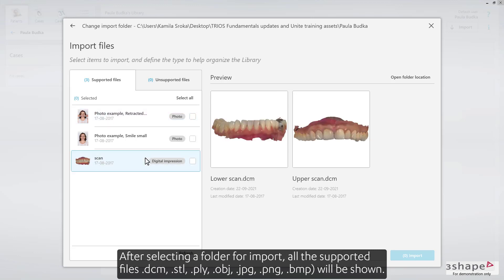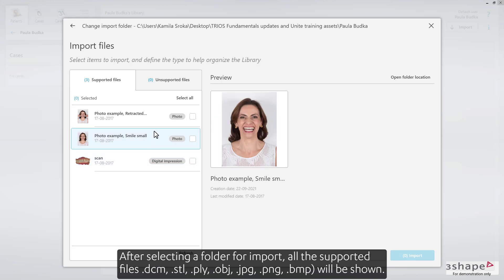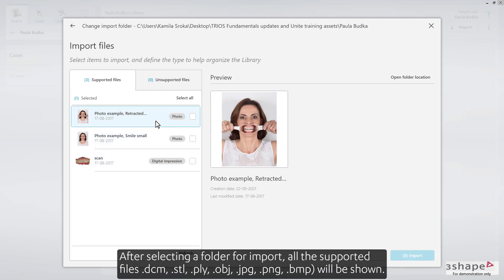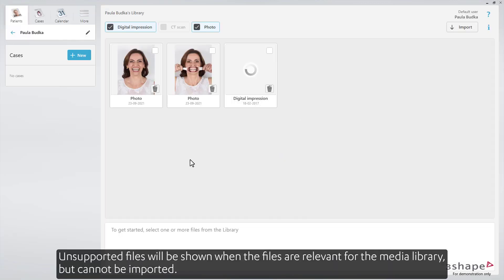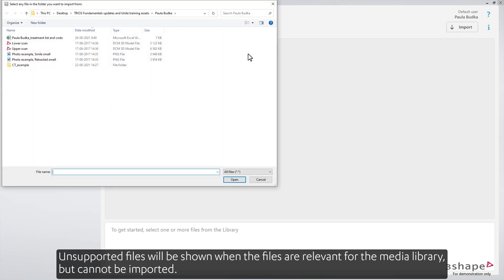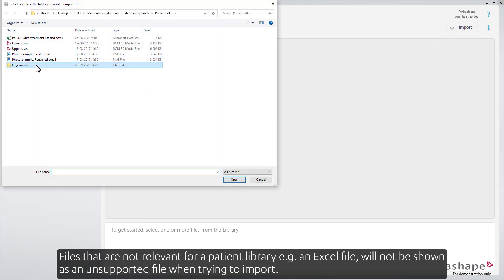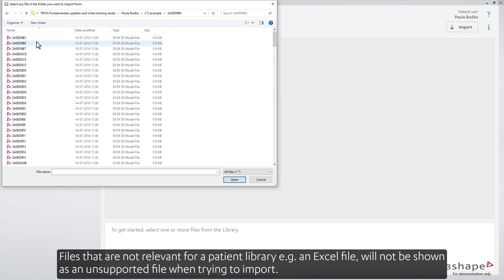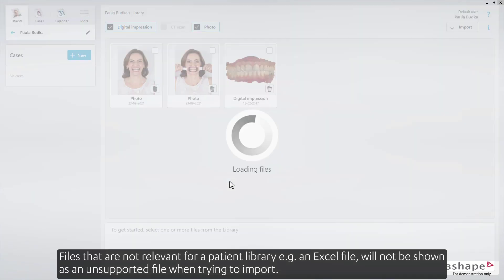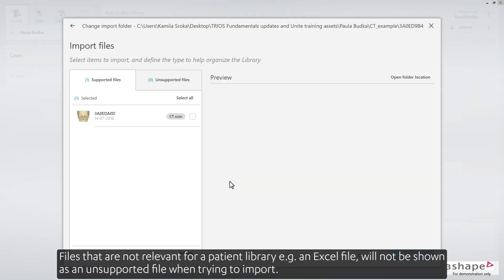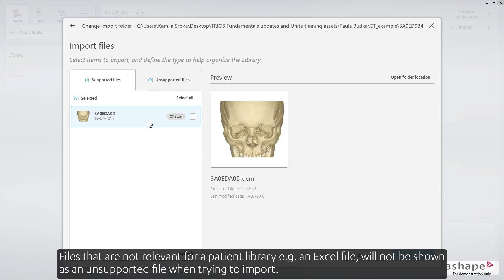After selecting a folder for import, all the supported files — DCM, STL, PLY, OBJ, JPG, PNG, and BMP — will be shown. Unsupported files will be shown when the files are relevant for the media library but cannot be imported. Files that are not relevant for a patient library, for example an Excel file, will not be shown as an unsupported file when trying to import.